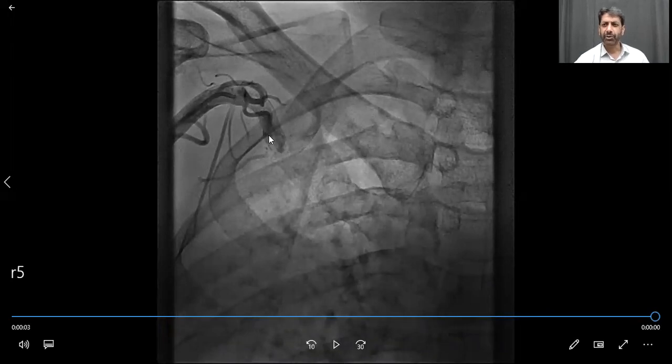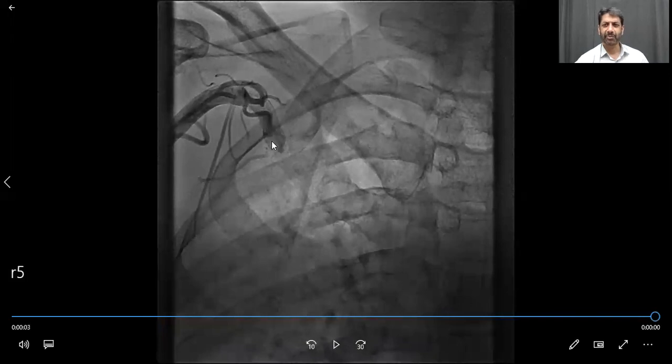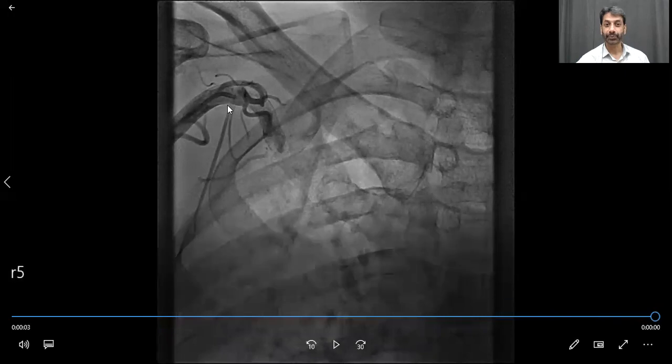And remember, when you're doing coronary angiogram or angioplasty or any procedure, never ever push or pull against resistance. Neither push nor pull if you have resistance. You have to think of what's going on. So what happened after taking the radial route, the cardiologist had a problem advancing the catheter from this point, actually wanting to go through this axillary to subclavian, ascending aorta and up to the coronary sinus.